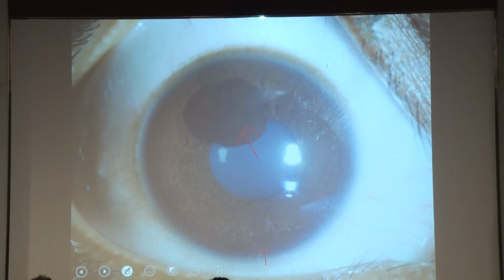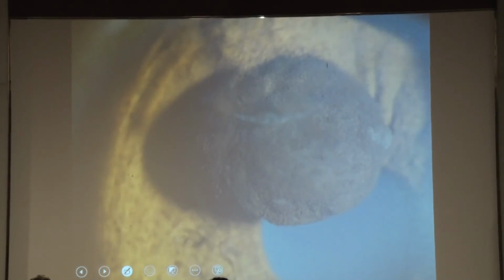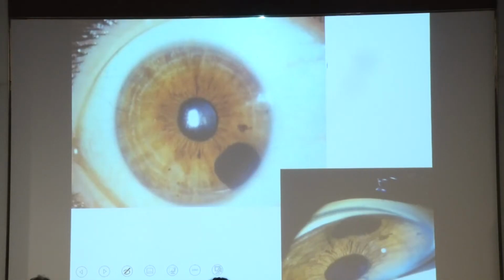Melanocytoma is full of pigment, it is pregnant with pigment, it sheds pigment, that settles in the anterior chamber, clogs the trabecular meshwork, and that causes elevation of intraocular pressure. That's a high magnification view. You see no blood vessel at all in it. It's relatively less vascular. Now if you have a diagnostic dilemma about an iris nevus, again look at the pupil.